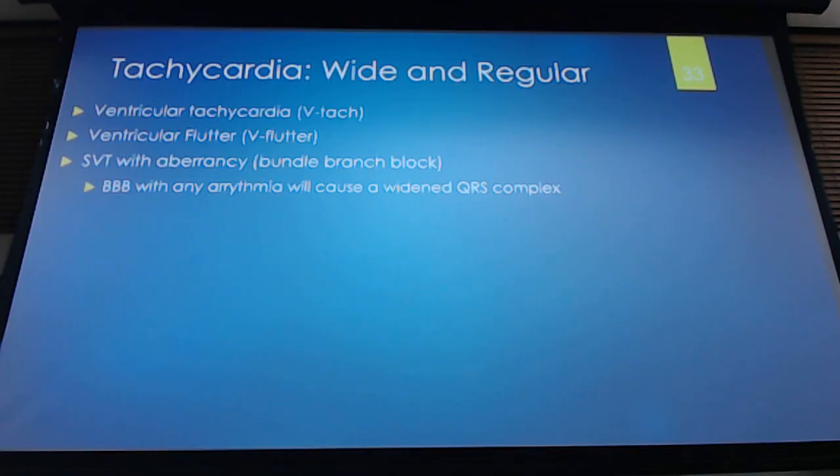All right, so we talked about tachycardia, narrow and regular: sinus tachycardia, SVT, and atrial flutter with a non-variable block.